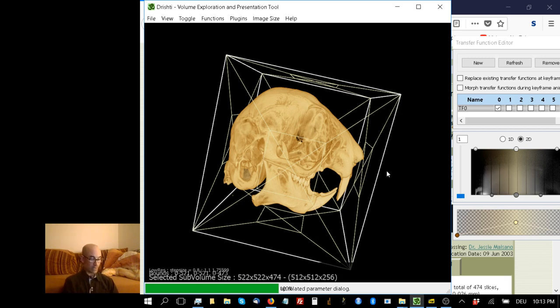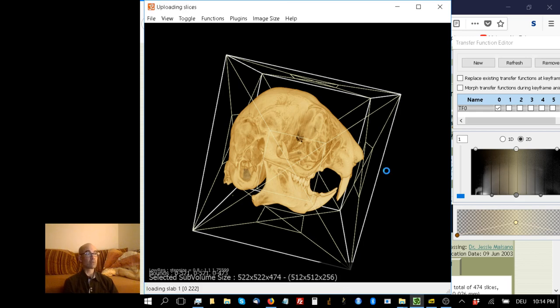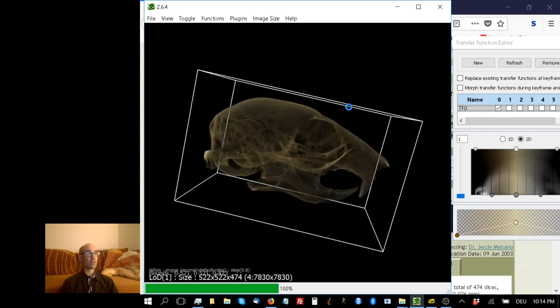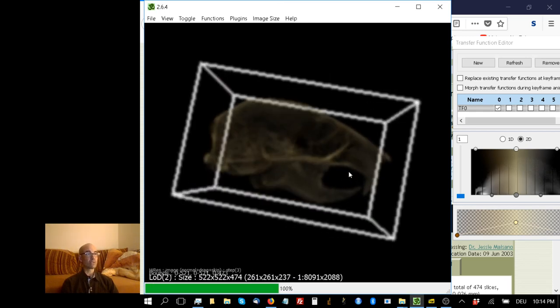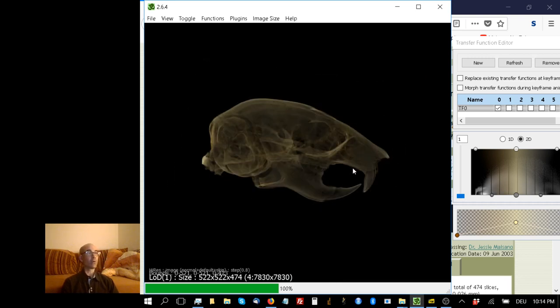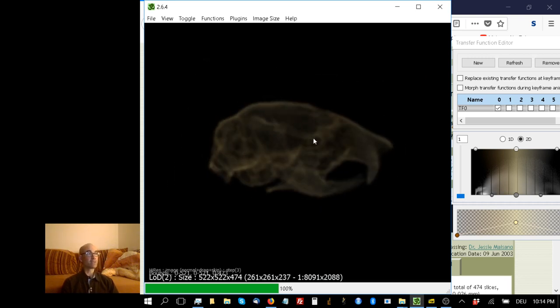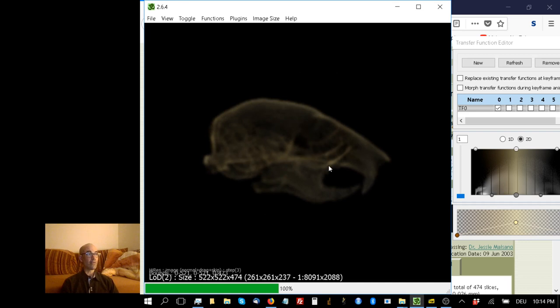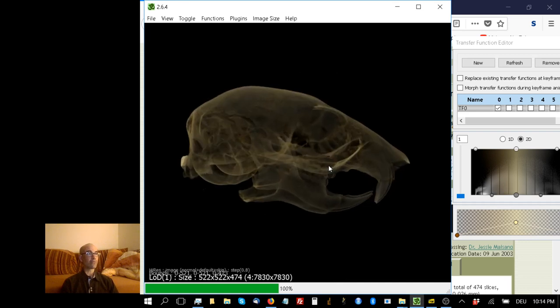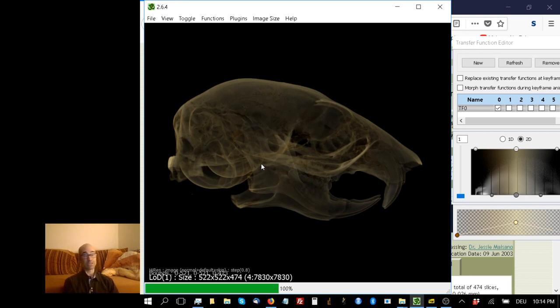It's not a problem, because the next step that anyone using Drishti needs to know is moving into the high-res mode. You do that by hitting F2. I'm going to hit F2 right now, and it's going to think about it. Now it renders correctly. I'll hit B to get rid of that box. Here we have the correct Z dimension that accounts for this discrepancy. The Z dimension was twice as long as the X and Y.